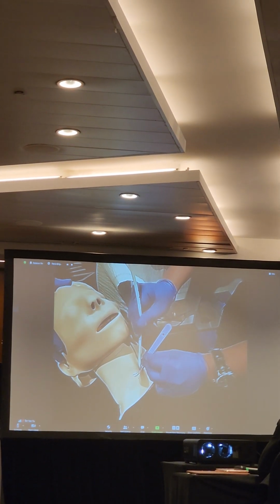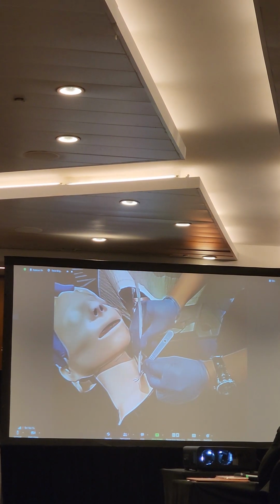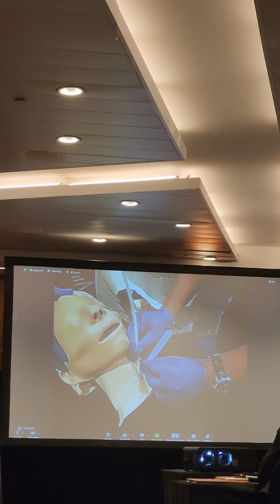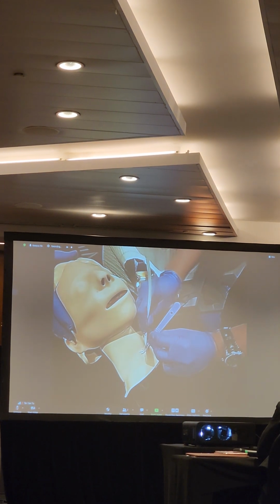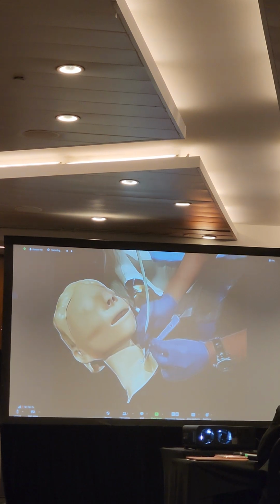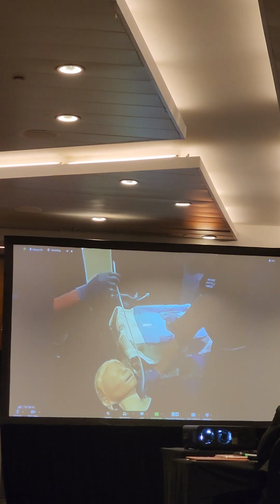If you have put in a bougie before for any intubations, you would know you'll be able to feel the tracheal rings. I can feel it in this particular mannequin as well. So now that I've entered, in this case I didn't require any dilation. Usually you do require a bit of dilation, either with the finger or artery forceps if required. And once you have the bougie in, you keep it stabilized in place while you remove the sharp away.